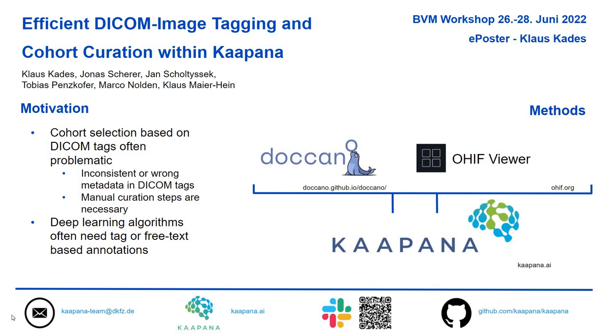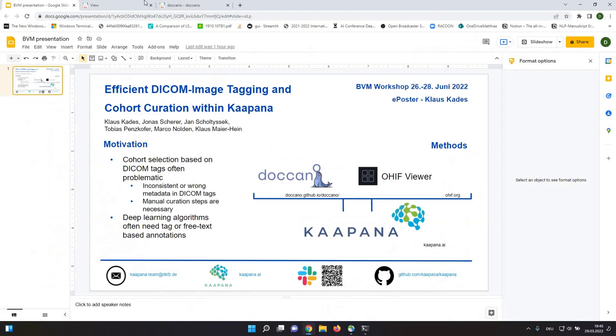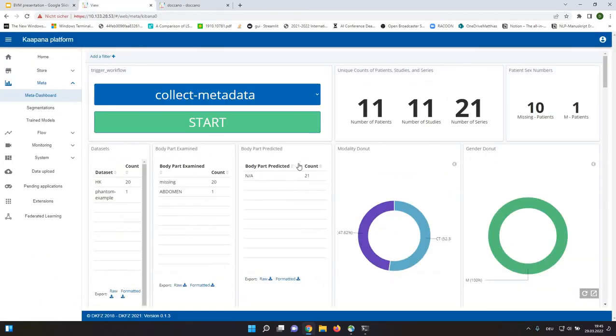This is where I want to jump into the live demo. Here you see a view of our metadata dashboard, where we illustrate the metadata of DICOM images. And here you can basically filter for DICOM metadata.